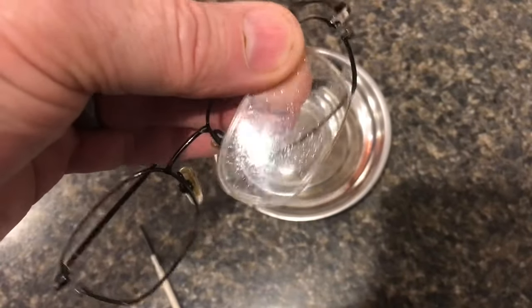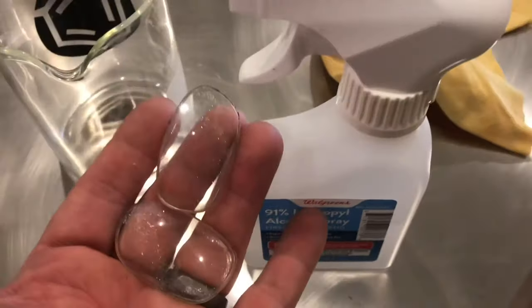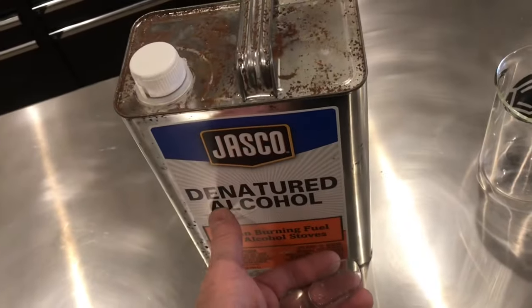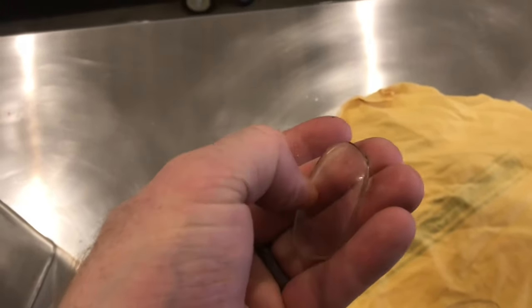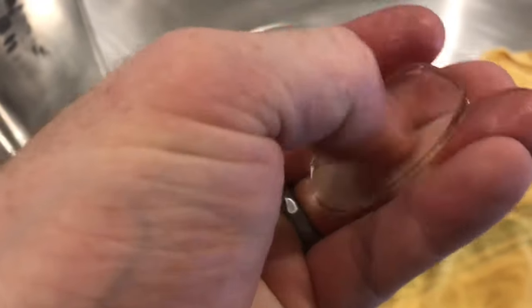You can really see that deterioration on that lens. We'll soak the lenses in 90% rubbing alcohol or denatured alcohol. We'll spray them down, let the alcohol soak, and scrape it with your fingernail. You can feel that coating start to come off.